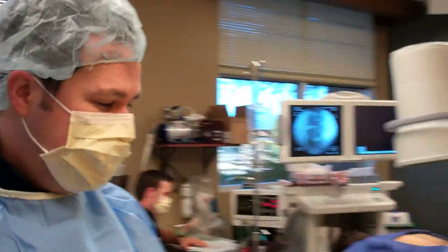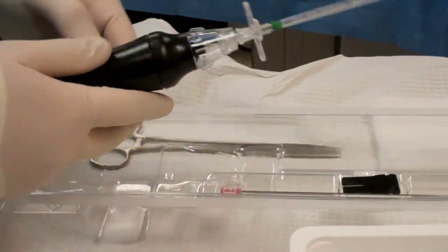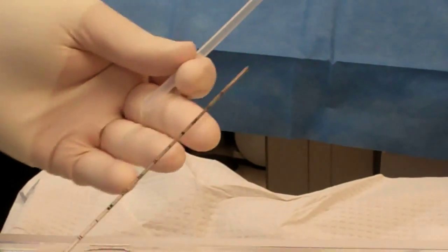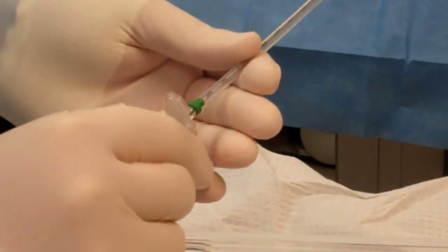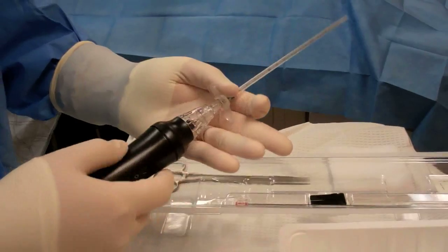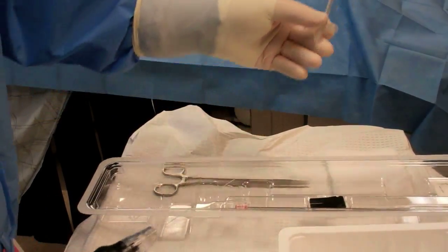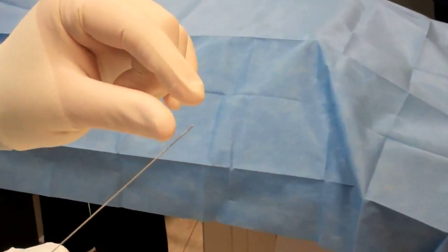First, I want to show you the equipment so you can understand that. Obviously, we have our numbing medicine, which we'll numb the skin with. This is the actual decompressor equipment here. There is a needle that we first introduce into the disc — it has a slight curve on the tip. Through that needle, we'll place the Stryker instrument. It slides right into the needle, screws in like this, and then it turns on like this.